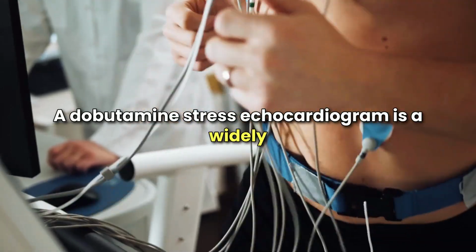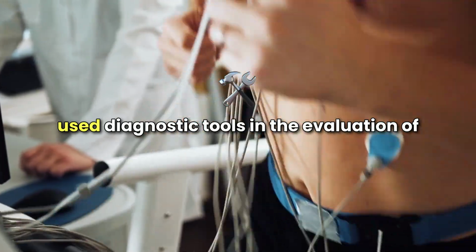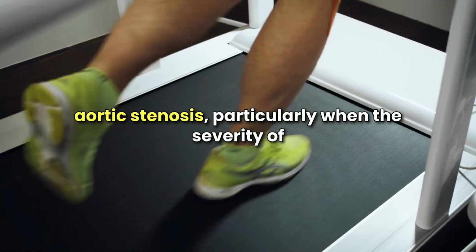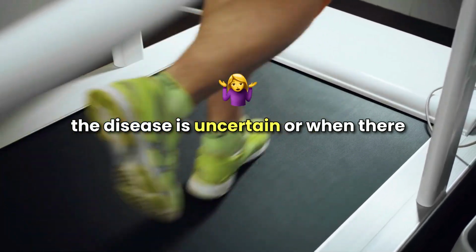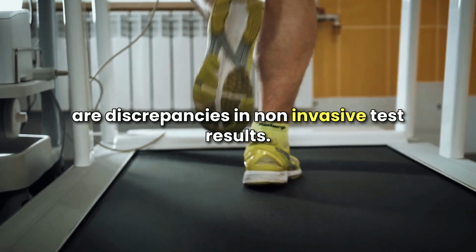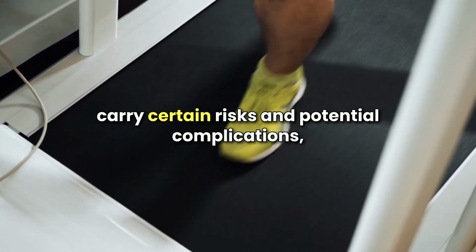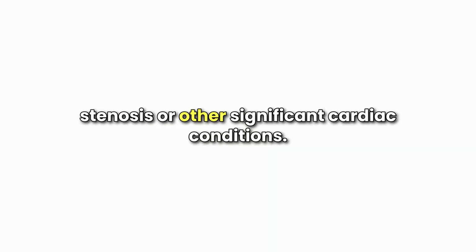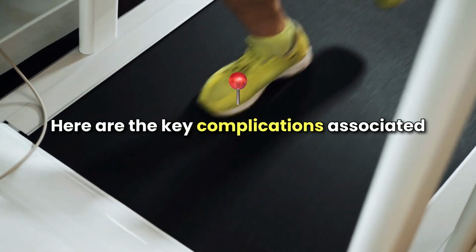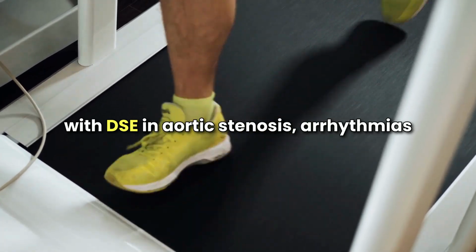A dobutamine stress echocardiogram, DSE, is a widely used diagnostic tool in the evaluation of aortic stenosis, particularly when the severity of the disease is uncertain or when there are discrepancies in non-invasive test results. While generally safe, the procedure does carry certain risks and potential complications, especially in patients with severe aortic stenosis or other significant cardiac conditions. Here are the key complications associated with DSE in aortic stenosis.